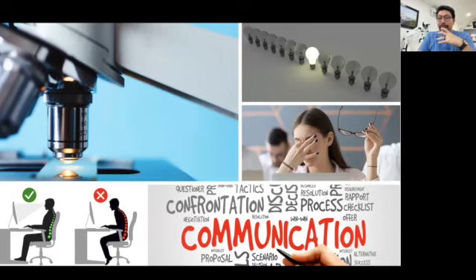Then we need to think about the health of the clinical practitioner, because the microscope will change your clinical posture. You will have a better ergonomics for working more comfortable, and you will feel more relaxed in your eyes, because you are not going to force the muscles of your eyes for trying to focus in the most posterior areas. And you are not going to need to go almost above the patient, very close to the patient, trying to have a proper focusing distance. So these two reasons are related to the clinical practitioner.